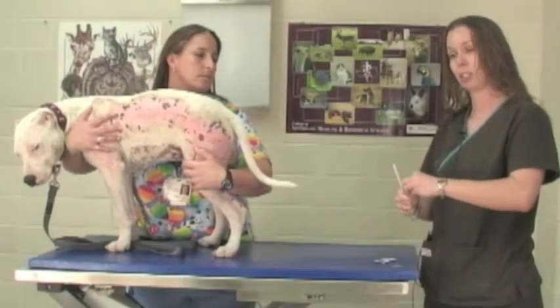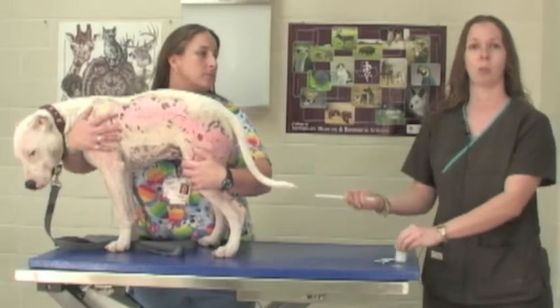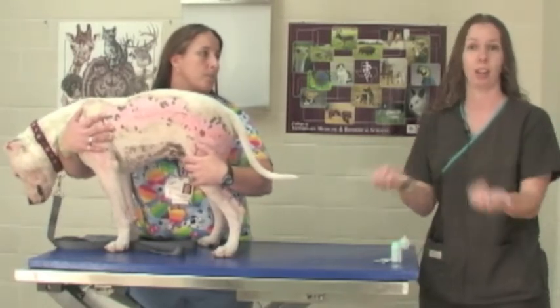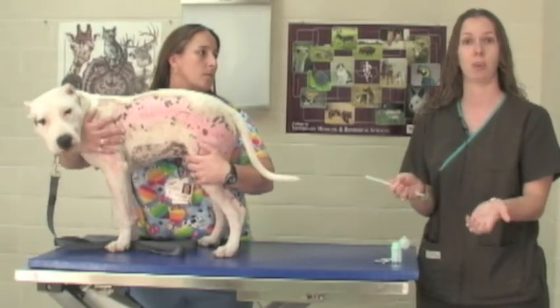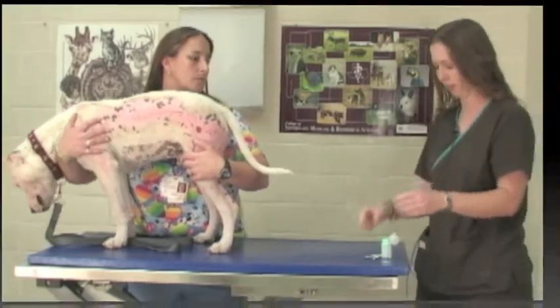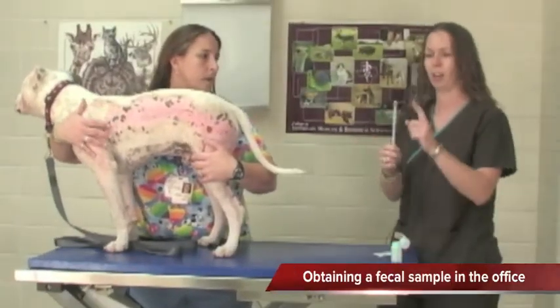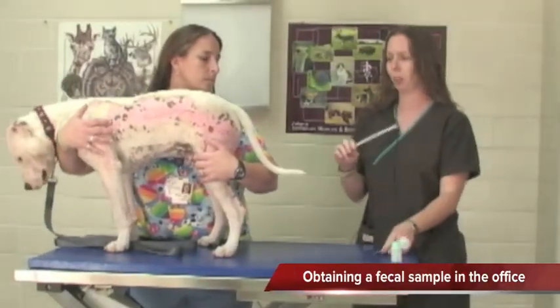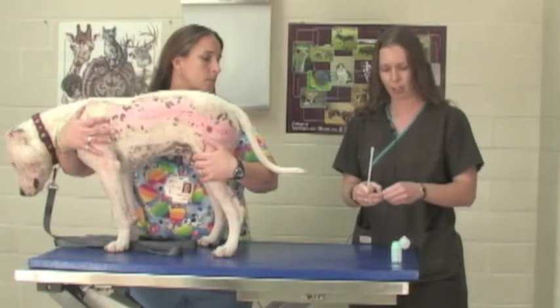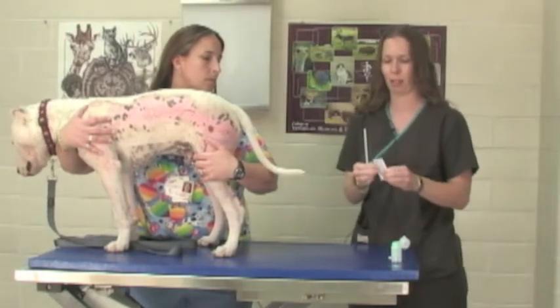If our patient comes in and the owner has collected a sample on their morning walk and brings it to us, we can analyze their fecal sample that way, or we can obtain one whenever they get to the office. In order to do that, we have a fecal loop and we are going to get a sample from our patient and then analyze that sample after it's obtained.